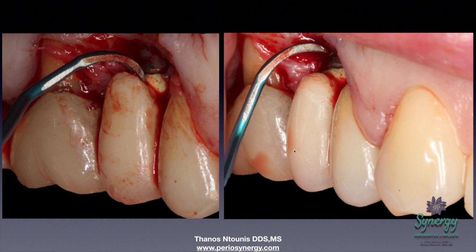This is a titanium scaler. You can see the amount of ledging that was previously there, and you can see how much different it looks on this particular slide after the reshaping of that particular crown.